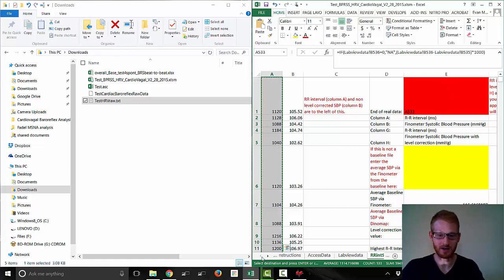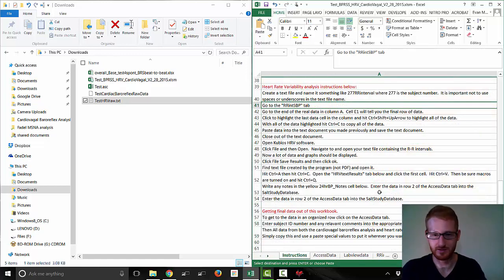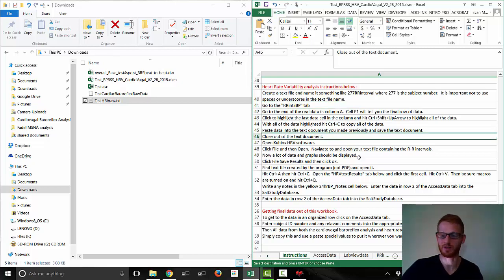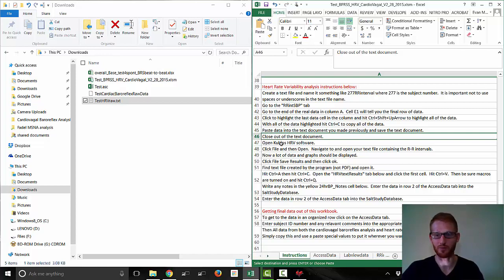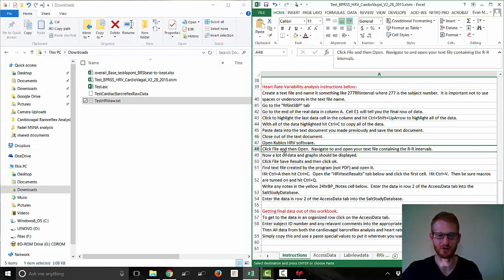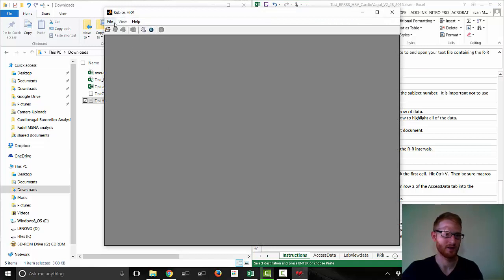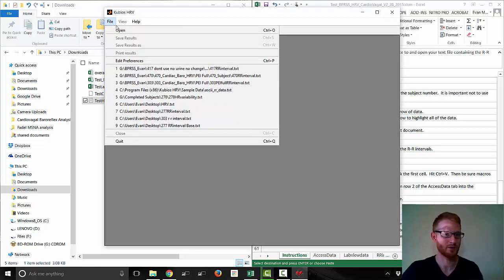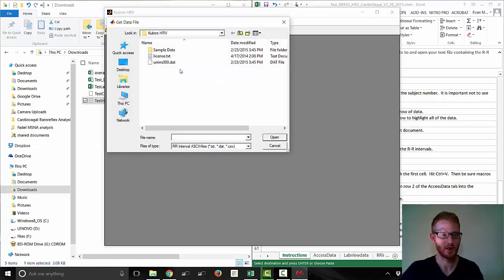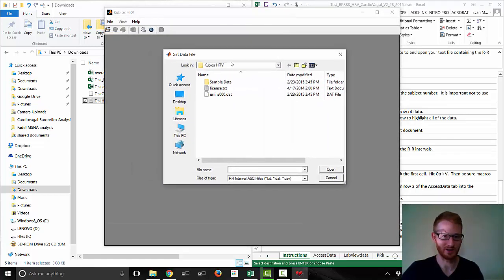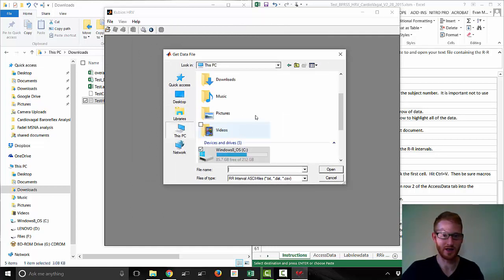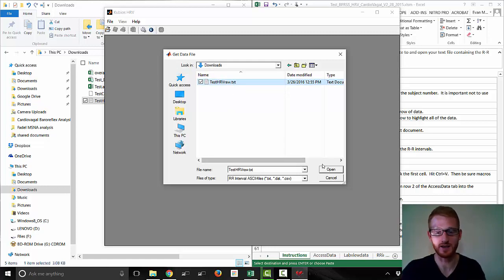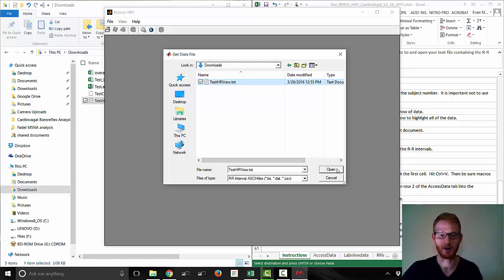Let's go back to the instructions tab. Now it's telling us to open the Kubios software, we already have that open, and then once you're in the software, you're going to click File and Open and navigate to this text file with all the RR interval data in it. So here's the software again, right now there's nothing loaded. We're going to go to File, we're going to go to Open, brings up a Windows dialog to find the data. I have it in the downloads folder, there it is - test HRV raw data, and it is a .txt text file. We're going to highlight it and just open it.